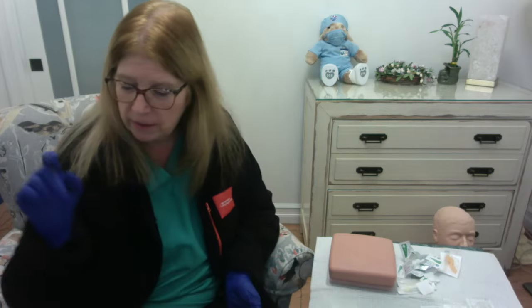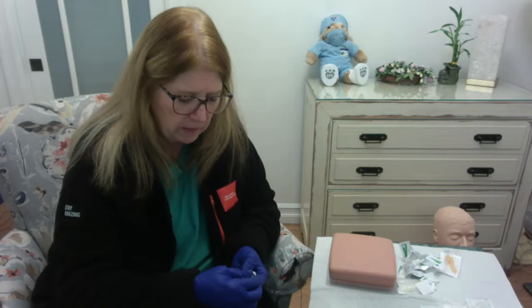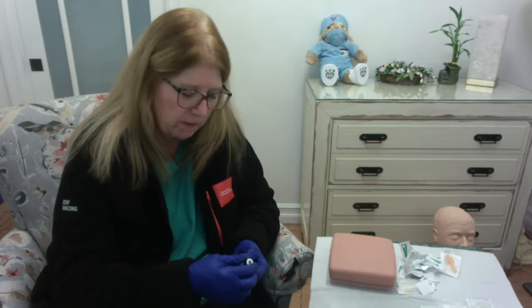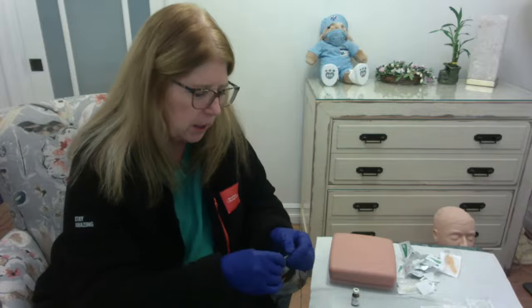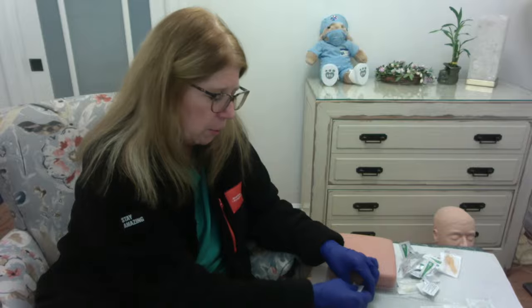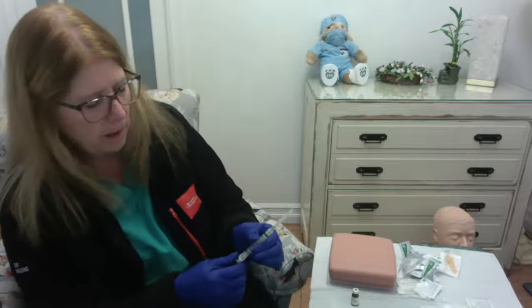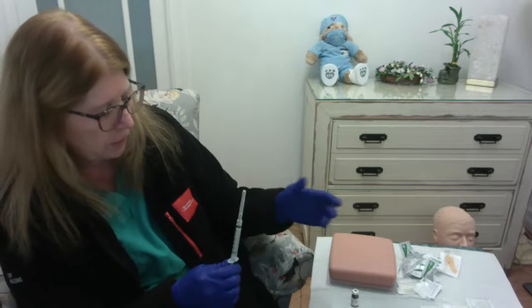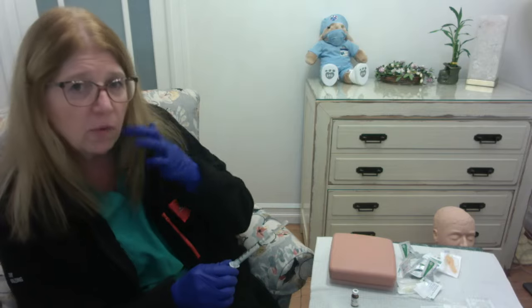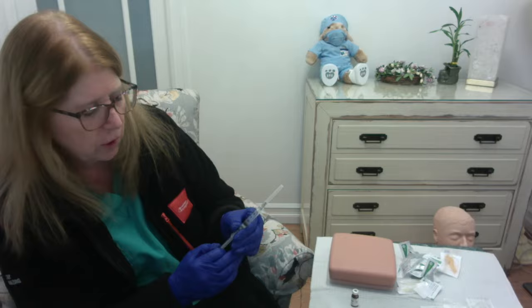All right, so let's give our patient some folic acid, okay? So this says 5 milligrams per milliliter, and this is a 2 milliliter vial. So again, I'm going to clean off the top of the vial. I have chosen my syringe and needle appropriately for IM. And we said there were 5 milligrams per milliliter. So let's say we have to give 10 milligrams. So that means I'm going to need 2 milliliters of solution.